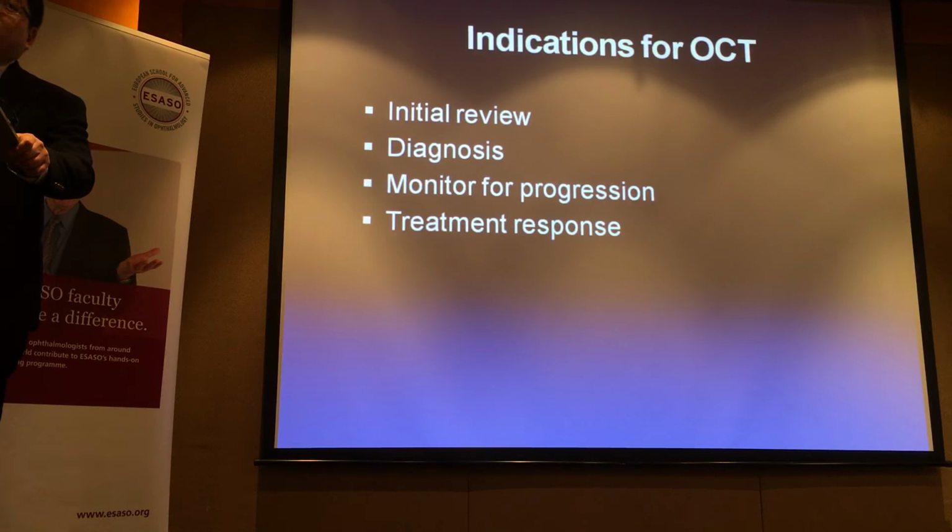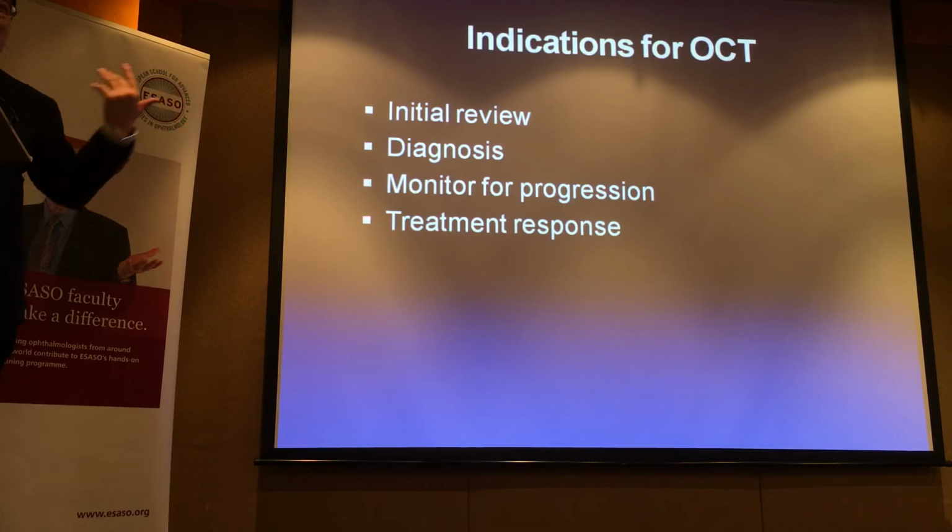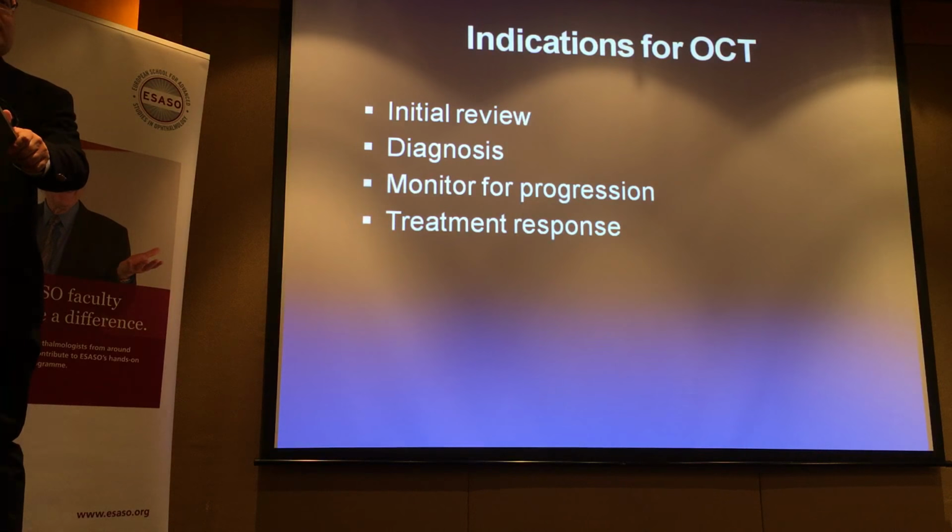And sometimes you might pick up things that you don't see clinically, all right? But I wouldn't go so far as to say I'll do this on everybody that walks in. You come in for a chalazion and I'm going to do an OCT on your eye, right? I mean, no good reason for that. But if there's enough reason for review, I will do an OCT. Sometimes it's a baseline, obviously, to help me make the diagnosis.